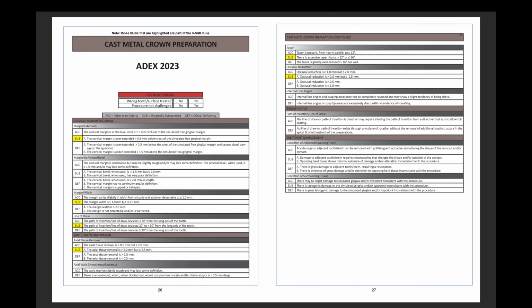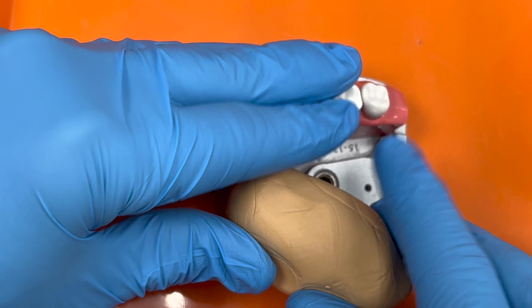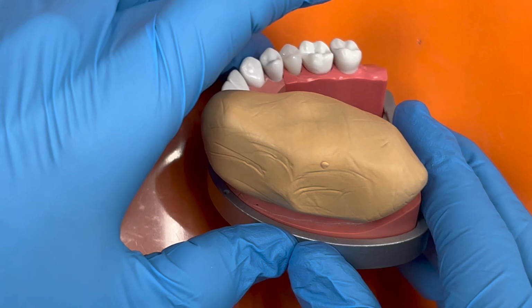This video is going to be on a full metal crown for a bridge on tooth number 3. Firstly, I start by making a putty that will be a reference for reduction.